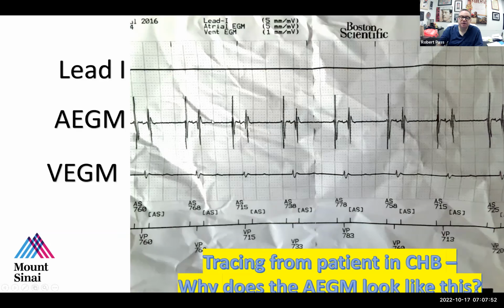And actually, when we're in the EP lab, as you guys know, usually the goal for the atrial catheter is to put it in the right atrial appendage. So the next time you're in the lab, look at the right atrial appendage atrial electrogram, which in our lab we usually notate in red. You'll notice oftentimes that there is a ventricular electrogram on it when we're in the right atrial appendage and hanging over the ventricle. So, okay.